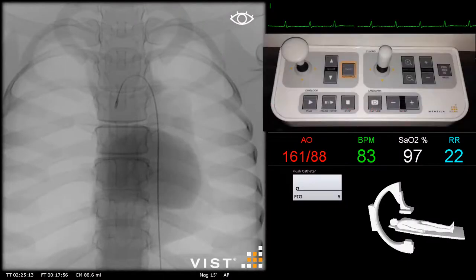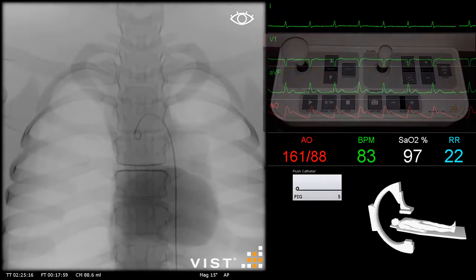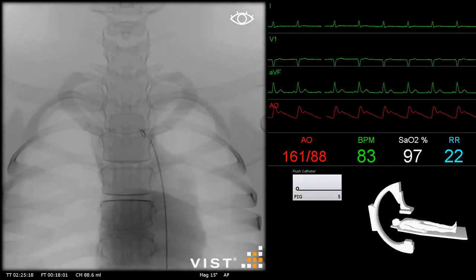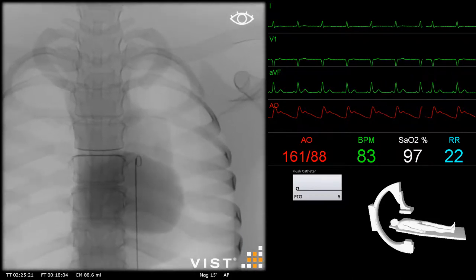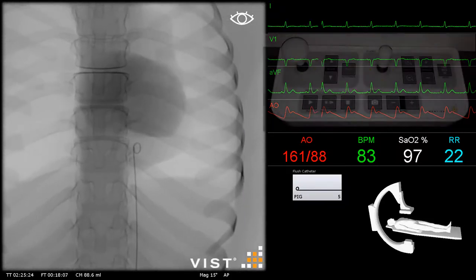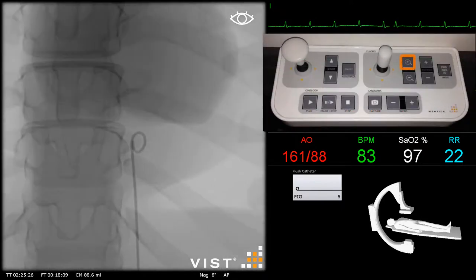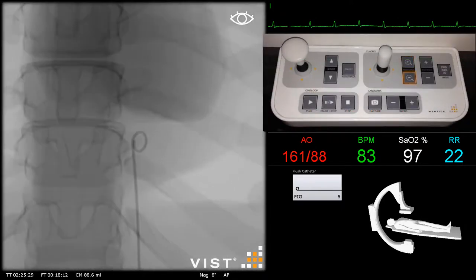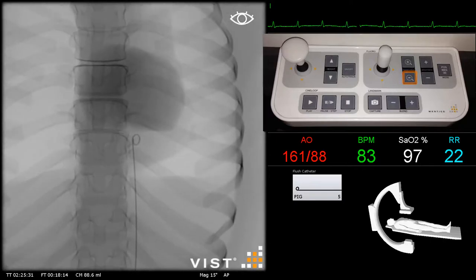By clicking the auto-track button on the VIST-C, the fluoro screen follows the most distal tool, as you can see here. By pressing the plus button we can zoom in, and by pressing the minus button we can zoom out.